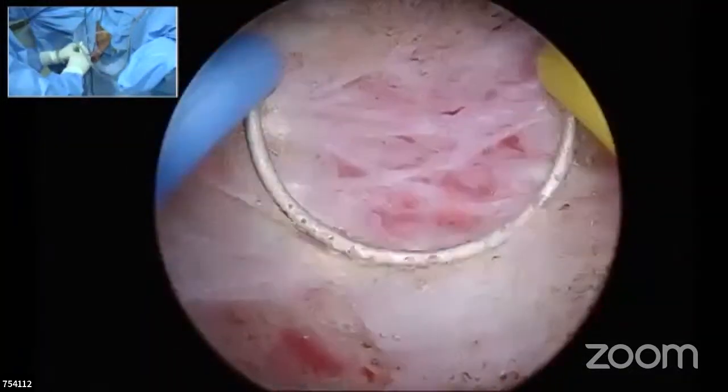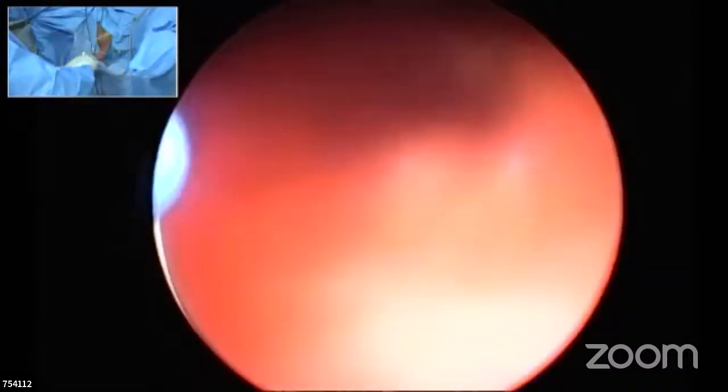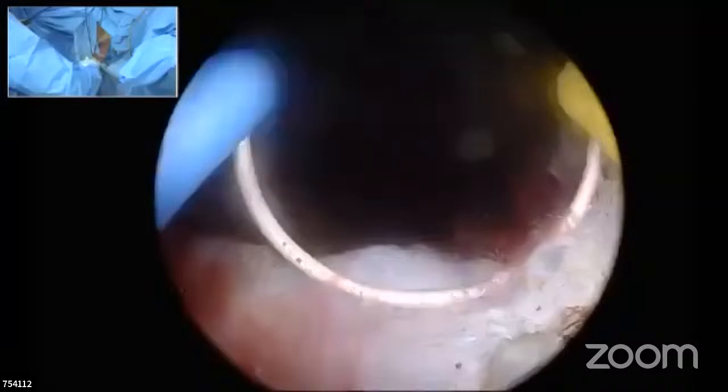And why you should do adequate resection, or remove these small chips also, is because they are the ones which can give rise to secondary hemorrhage. They get necrosed, dissolved, and the patient may start having secondary bleeding. So you should try to clean the capsule as much as possible.